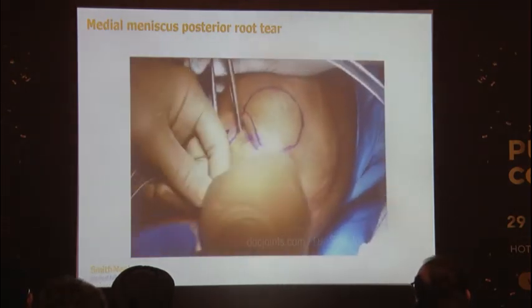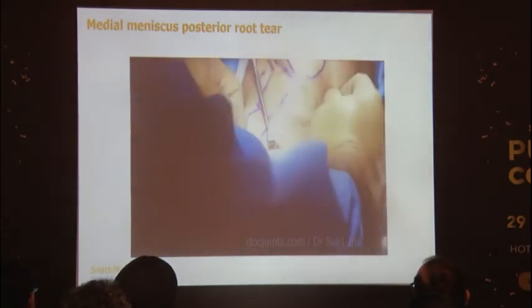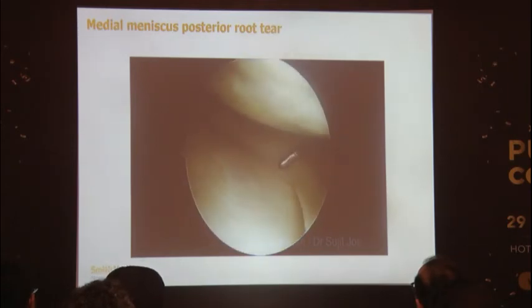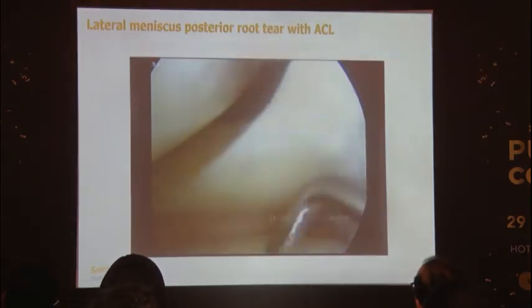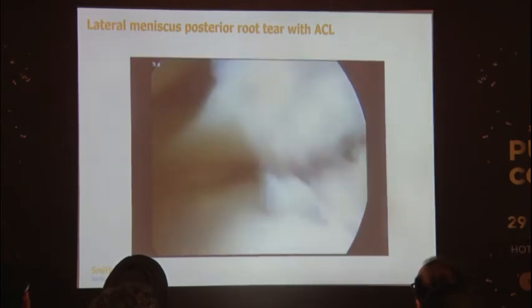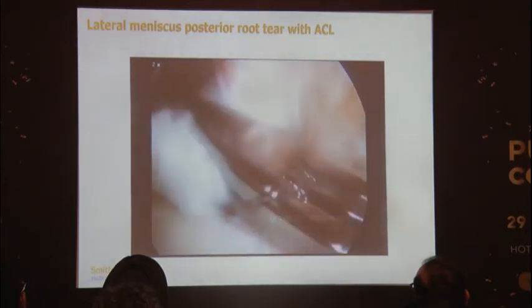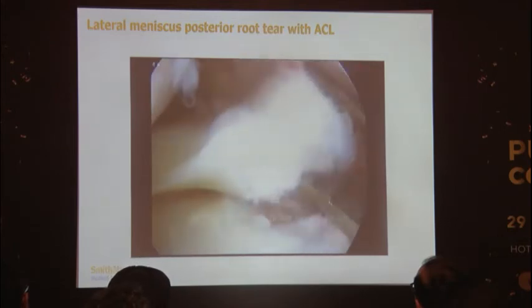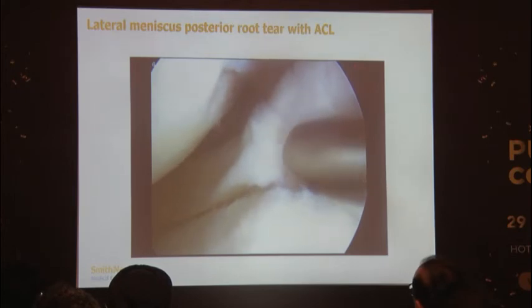Tensioning is done at 20 degrees of flexion, and you can see the tension on the meniscus has been recreated. The endobutton is what the root is repaired over. There is another patient with a lateral meniscus posterior root tear — you can see it's detached. He was a 30-year-old man with good cartilage on the lateral side. A similar method was used, and here an indirect suture-passing device was used, with the meniscus root being reduced to its location and the area of attachment cleared of cartilage using a rotary burr.